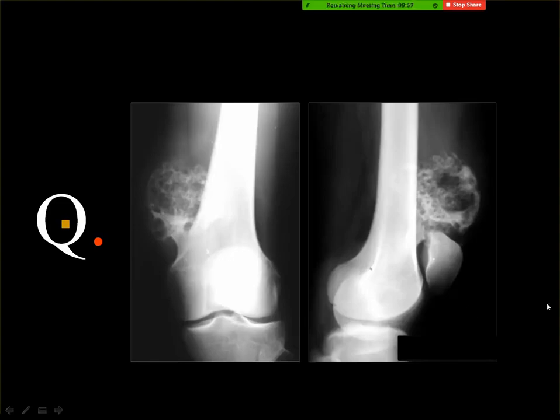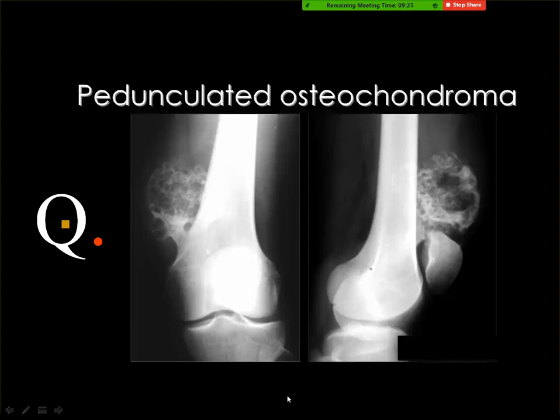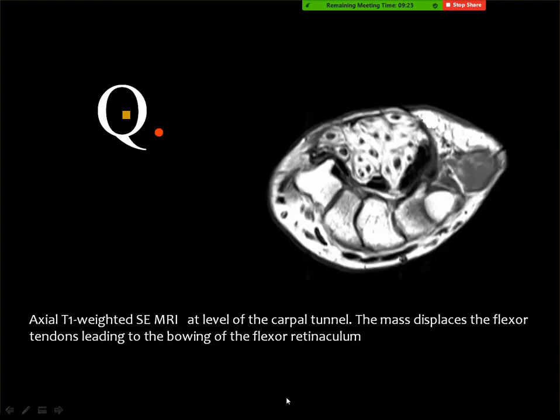Osteochondroma. Osteochondrosarcoma? Yes, no. This is an osteochondroma. In order to diagnose chondrosarcoma, you should see destructive changes in the surface of the osteochondroma, and you may get also some soft tissue swelling which is associated with it. If you do not see this, you cannot say that this is malignant degeneration. This is just an osteochondroma, the pedunculated type.